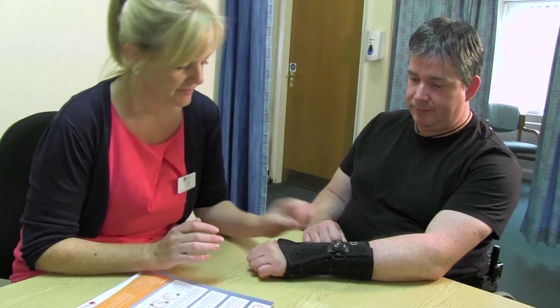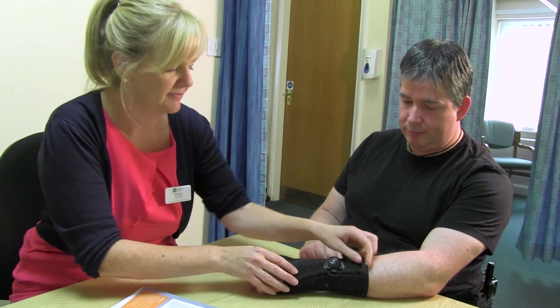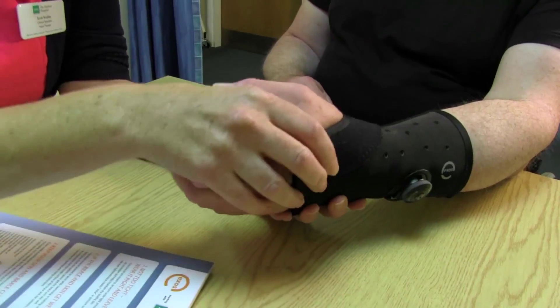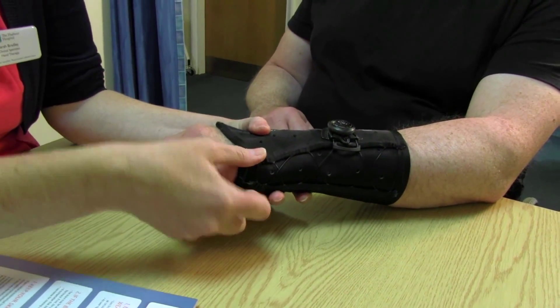The condition I have is Kienbock's disease, which affects the bones in the wrist and gives me excruciating pain. This Exos Brace is a lot stronger and much more comfortable. It's more usable with all the holes and the way it's designed — it's more molded to my wrist and gives a firmer grip. Because I'm in a wheelchair a lot, the brace has been very strong and very durable for me, and it's taken away a lot of the pain.